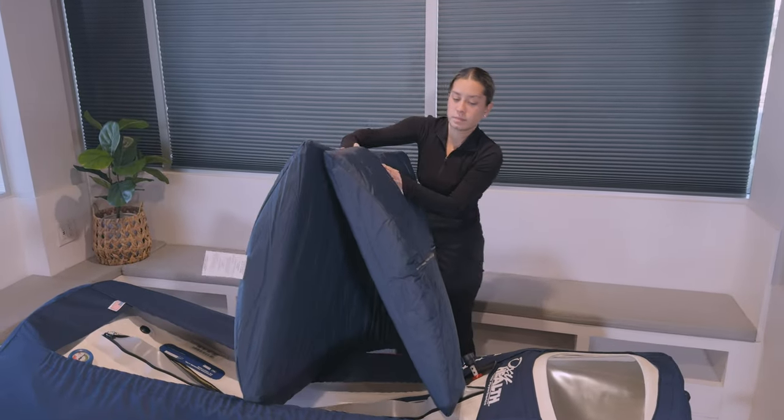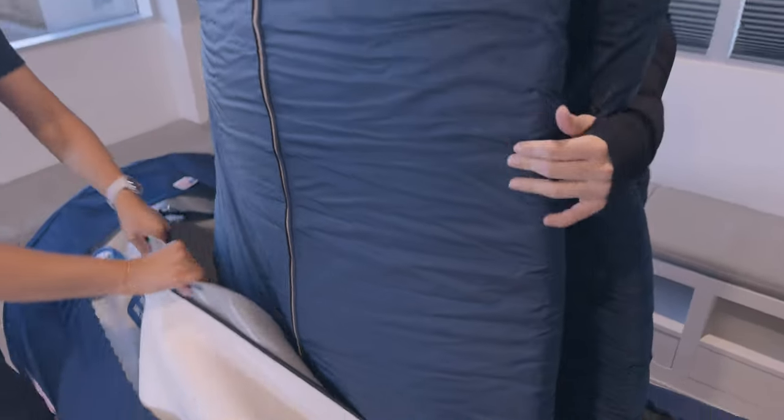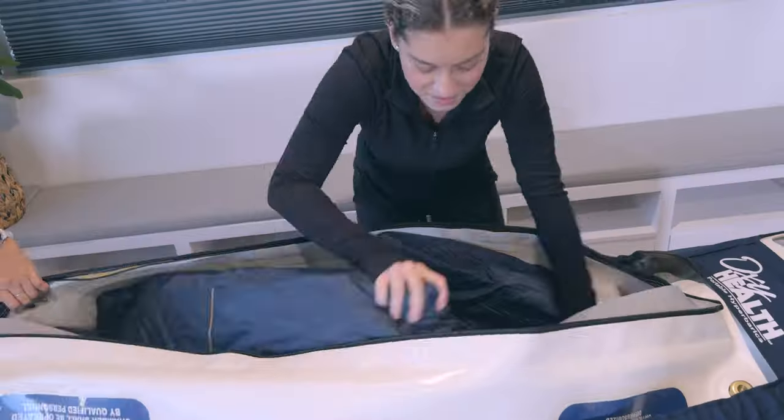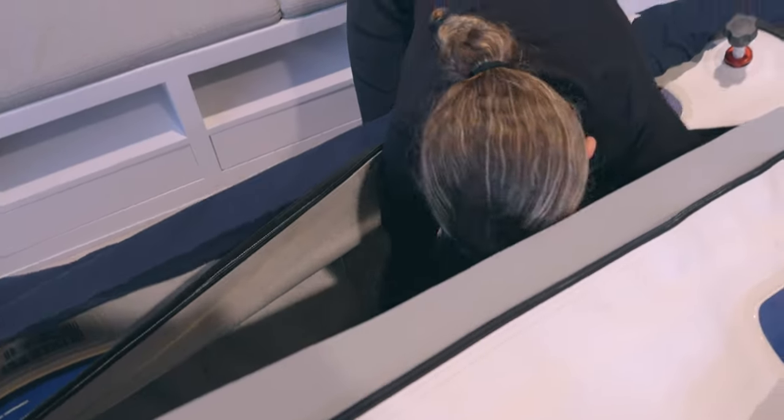To insert the mattress, fold it in half with the zippers facing out. Place the folded mattress sideways into the zipper opening of the chamber. Twist the mattress so that one end goes in the direction of the head and the other toward the foot. Smooth out and flatten to adjust.